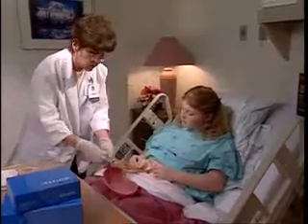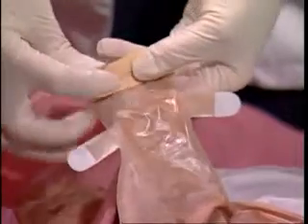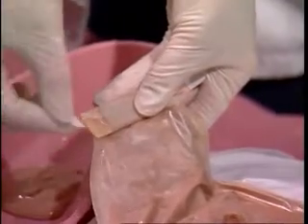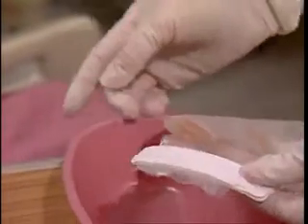Finally, if you have a pouch with a Velcro closure, bend the small foam plate over the large foam plate. Roll the end of the pouch in two more times until the Velcro is visible, then lay the Velcro tabs in place and press together. If you have a pouch with a clamp, uncuff the end of the pouch and replace the clamp. Once the pouch is closed, it will once again be odor proof.